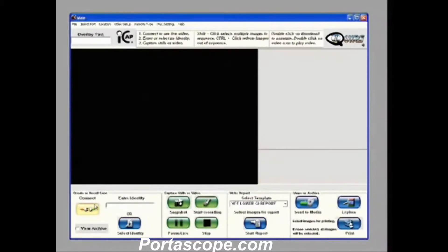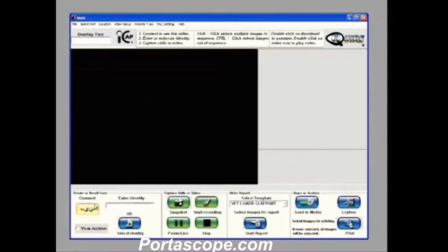Today I'd like to demonstrate our iCAP system for you. iCAP is designed to be easy to use. It's got large buttons so it can be used with or without a touch screen, and it's really easy to navigate. The instructions are very simple. Up here at the top of the screen you'll notice it's number 1, 2, and 3.